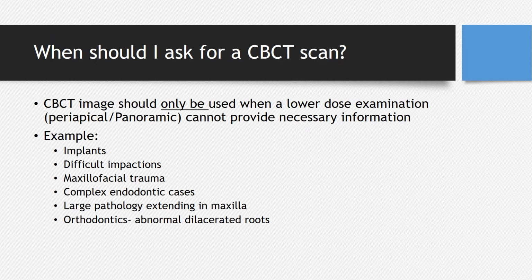So when should you ask for a CBCT scan? The images should only be used when a lower dose examination like a periapical or panoramic radiograph cannot provide necessary information. Now, just because you have CBCT scan access, we don't recommend it for all patients because there is a certain amount of cost involved and radiation exposure involved.